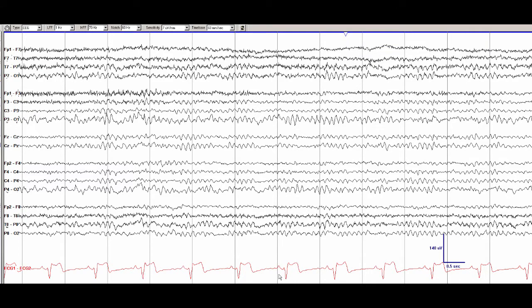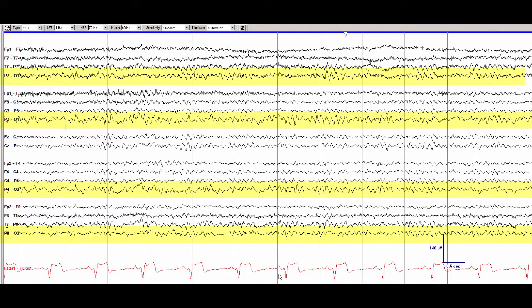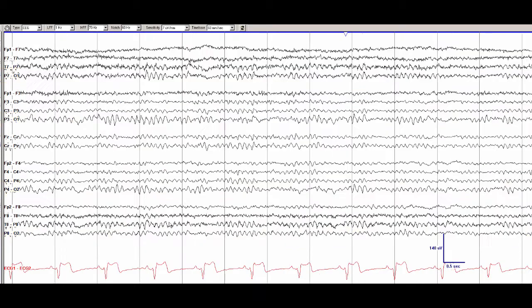You'll note that this patient is awake right now as shown by the presence of the bilateral posterior dominant rhythm which is symmetrical and about 9 Hz.